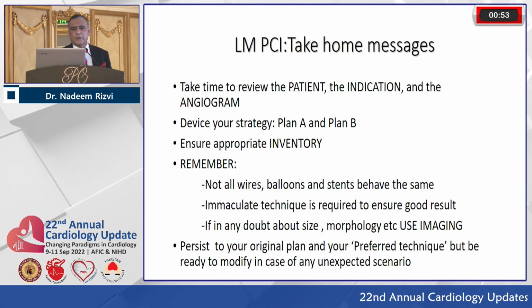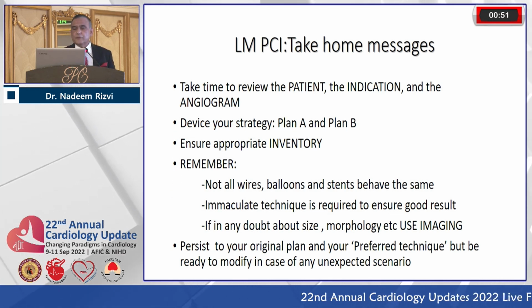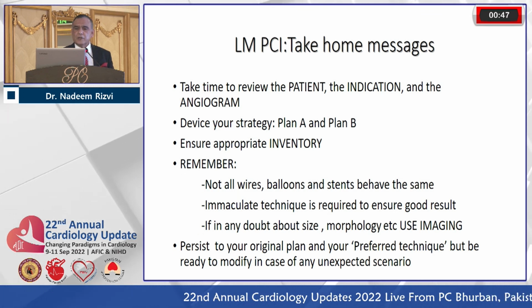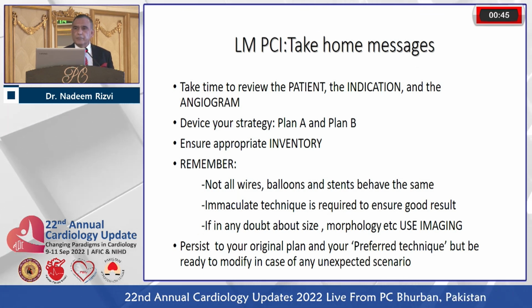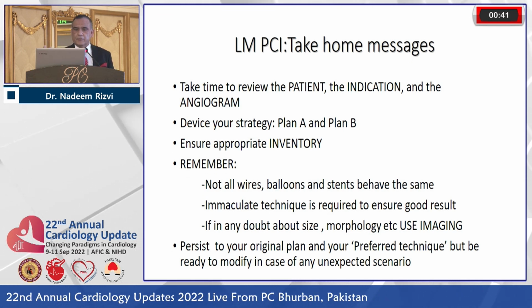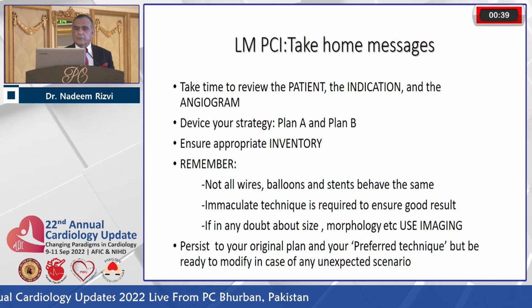The take home message is to take your time to review the patient, the indication and the angiogram. Devise your strategy. There has to be a plan A and a plan B, and write it down or at least discuss it with the fellow. Have 2 operators doing left mains. Ensure that all the inventory is there.